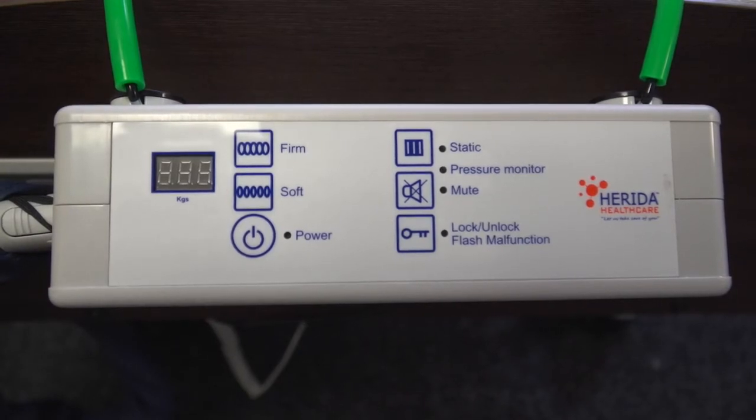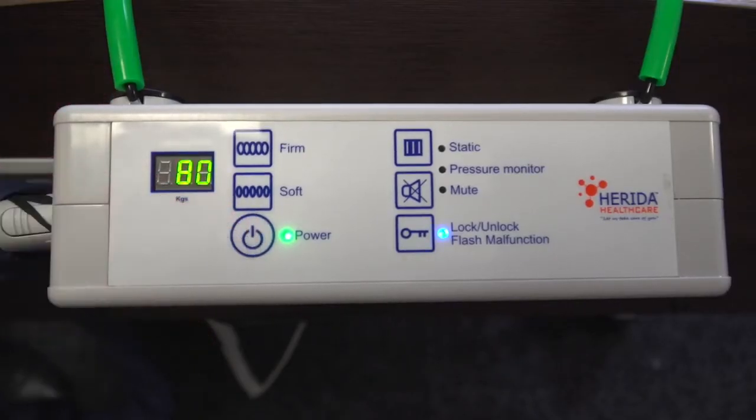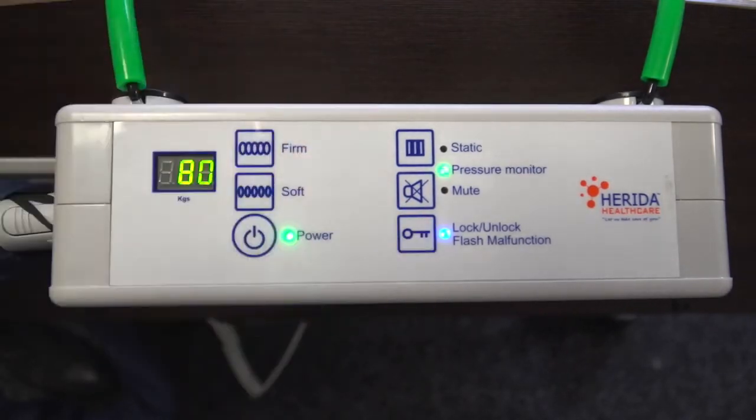Switch the pump on at the power socket and press the power button on the control panel. The pump will automatically inflate to 80kg, which offers 20mm of mercury pressure into the cells. To set the pump to operate with the patient's weight, we need to first unlock the pump. Hold down the lock/unlock button for 3 seconds. The pump will sound a short beep and the blue LED light will go off once the pump is unlocked.